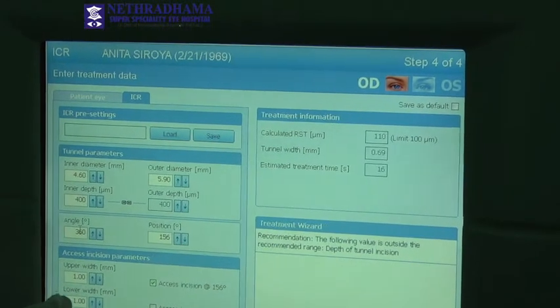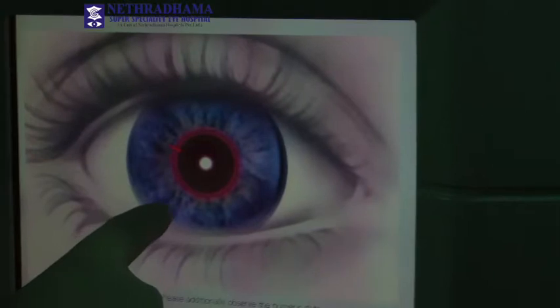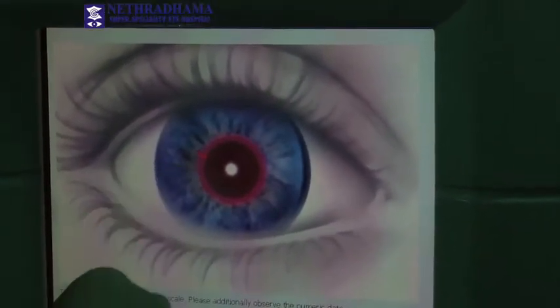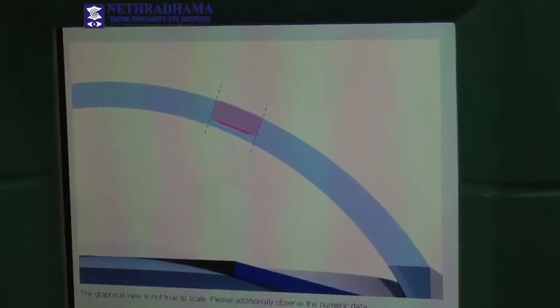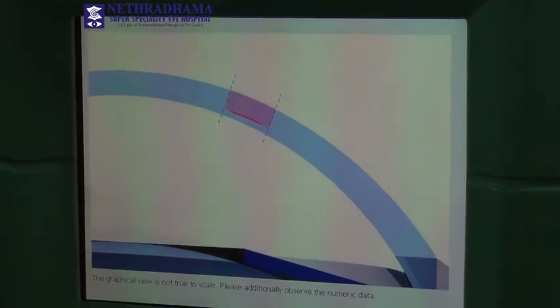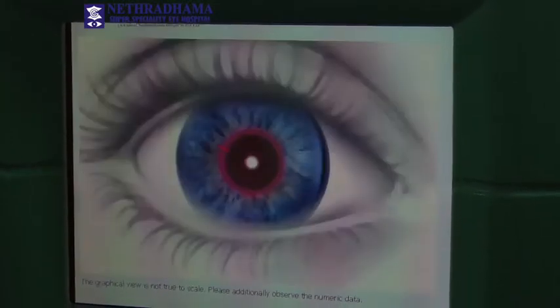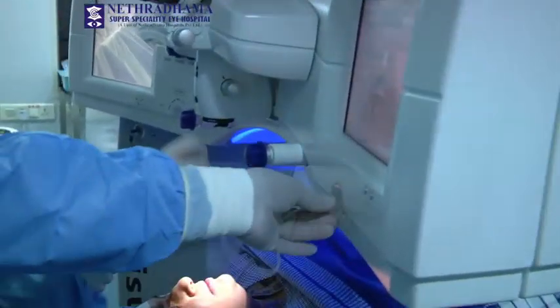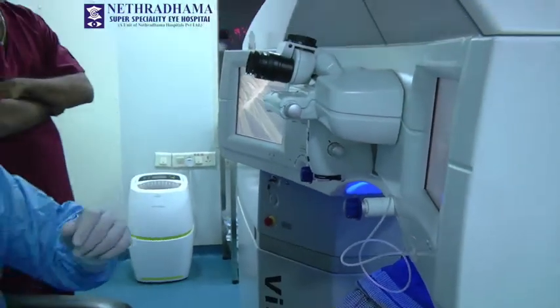The axis incision is a 1mm incision at 156 degrees. You can see this is the 5mm zone, the incision is at 156 degrees, and these are the channels which are created at a depth of about 80%. The corneal thickness here is about 470 microns, so they will be implanting the rings at a depth of 400 microns. This is the patient interface and the cone is getting calibrated.